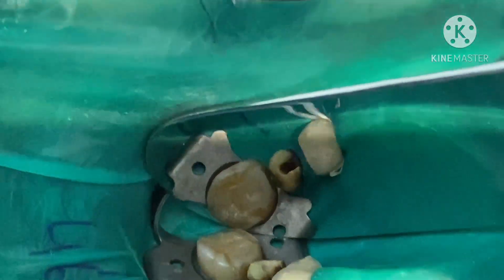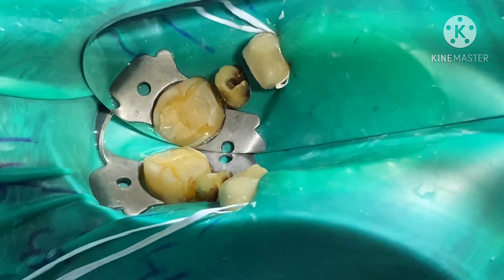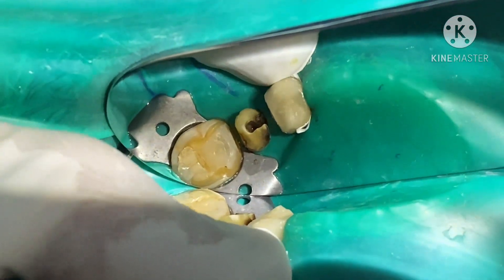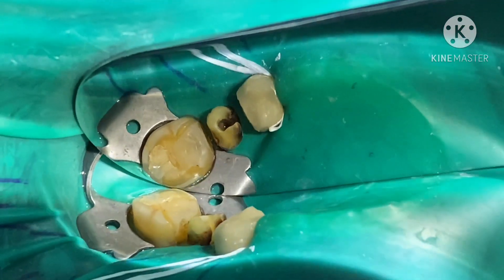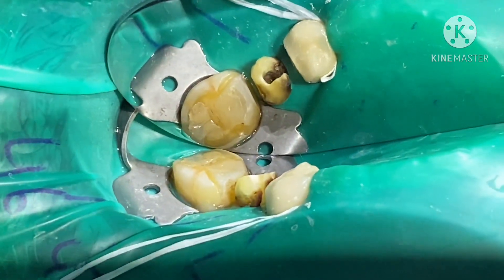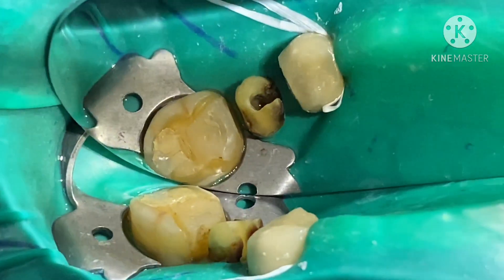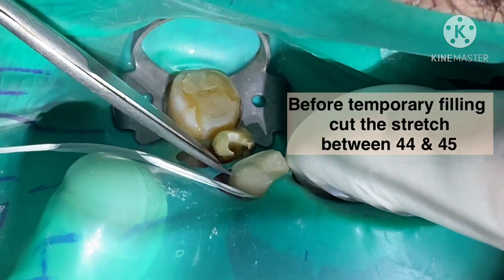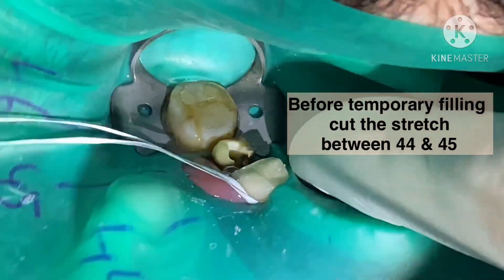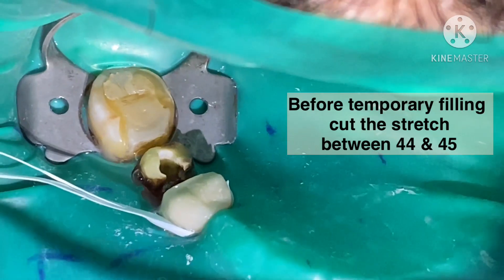Now with this type of punch, we can see that the whole gingival wall of the MO cavity is visible and the rubber dam hugs on teeth 4-4, and the whole of 4-5 is totally exposed to operate. I have done the root canal in this case, and before we give the temporary filling, we stretch this portion and then cut it like this. The filling after placement would not come out when we remove the rubber dam.